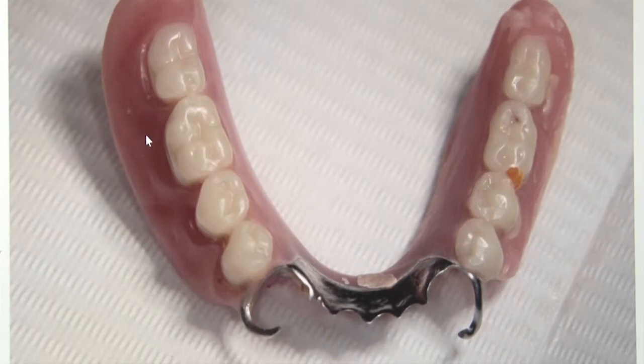And the problem for her is that even though she has an upper complete denture against a lower removable partial denture, this is a long lever arm. And because it's a long lever arm, she's getting a lot of movement along the fulcrum, which is just the distal of the tooth number 43 and the distal of the tooth number 33. And she says that upper complete denture is not a problem.